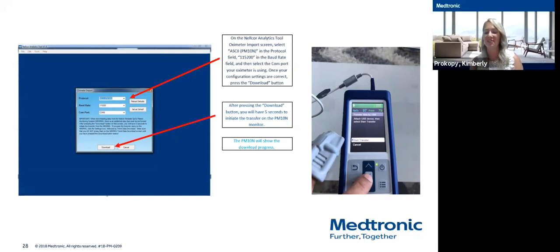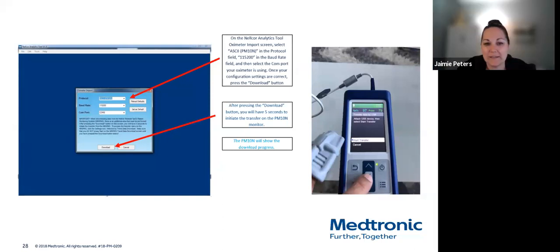They do listen to us with some things. We were asking for changes to the Shiley Airways for a long time, and they did make really great changes. So they do listen, sometimes it just takes a little while. I think I just answered Joan's question too. Is there a way to set the machine when doing exertional testing? Yes, you did. If you didn't catch that, Joan, I can talk to you after, but basically the answer is no.